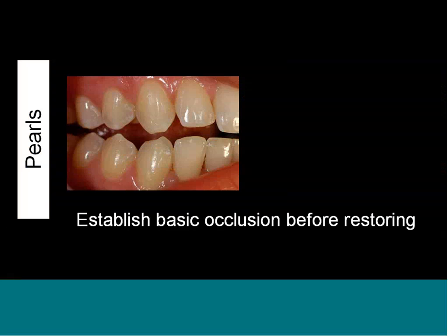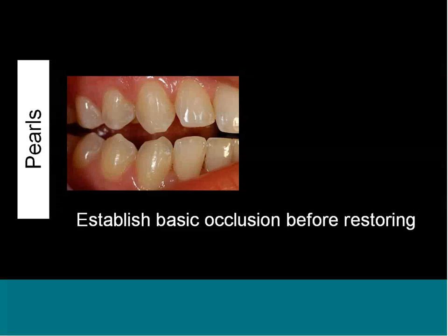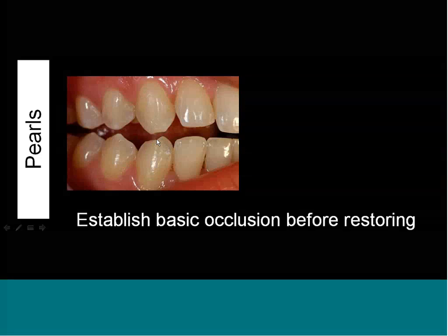A couple other little hints here. I know we're talking about posteriors, but a lot of the time when we're restoring these teeth, we're forced into either making really flat teeth or somewhat altered occlusion because the patient's worn away their anterior. So something you might want to look at is checking the patient's anterior disclusion, their canine rise and their protrusive. And if it's missing, why wouldn't you want to just restore that for them? Because it's real simple. It's one shade of composite. You're just roughing up a little enamel, etching, applying an adhesive, and adding that, providing, of course, the patient A, gives their permission, and B, wants to take care of the fee for this procedure. But restoring their canine rise gives you more freedom when you're doing the anatomy on the posterior tooth.